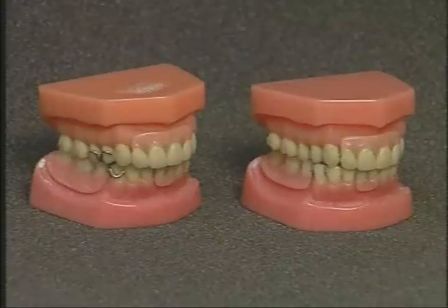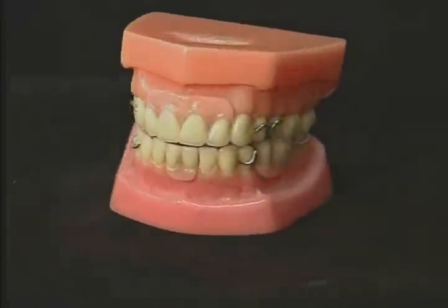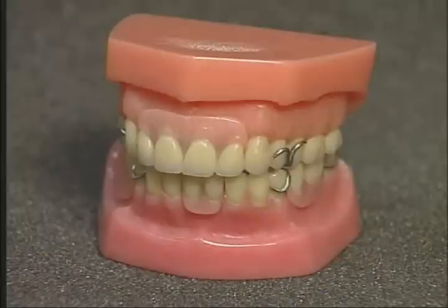Which set of partial dentures would your patients prefer to wear? The conventionally designed Class I lever partials with unsightly clasps which will destroy the abutment teeth and show when your patient is talking or smiling.